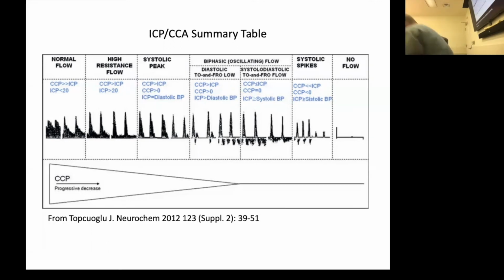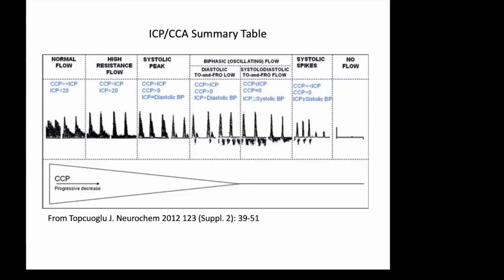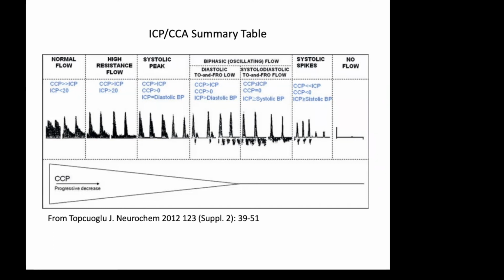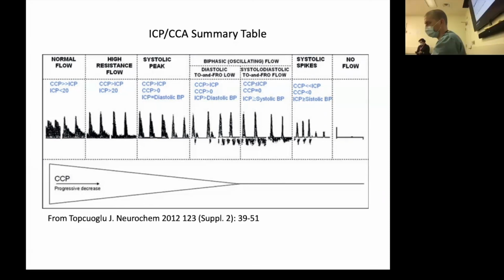Dustin, when it comes to vasospasm, we seem to focus a lot just on MCA. How important is it to be able to insonate the other vessels when you're looking for vasospasm specifically, or is a proximal or an M2 MCA good enough?